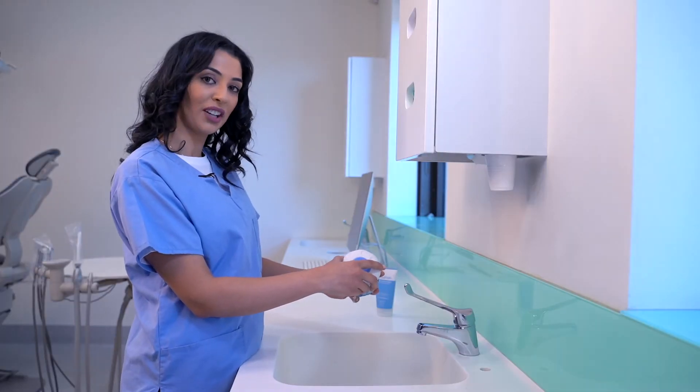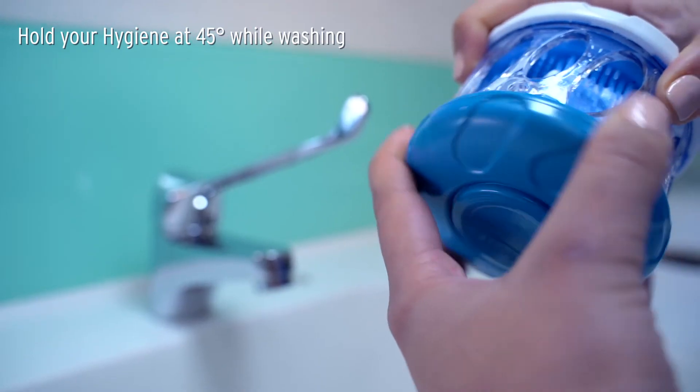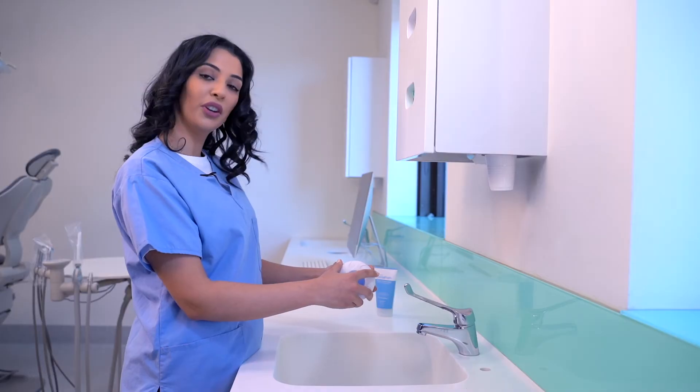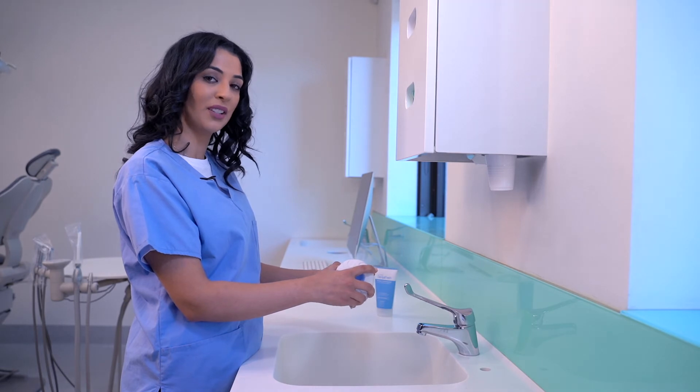There are three washing actions: you can do a top wash, a bottom wash, or a multi wash. Wash for 30 to 45 seconds, or until your dental appliance is fully coated with Dental Fresh foam.